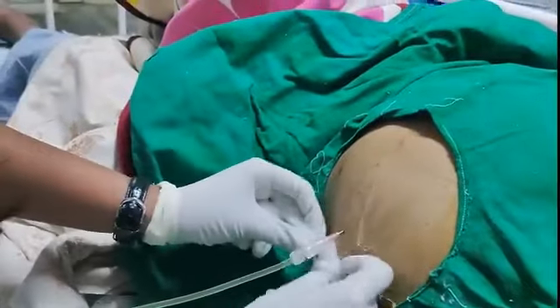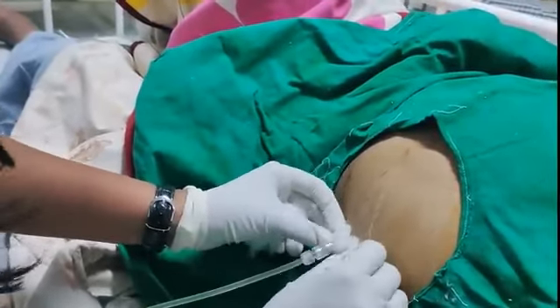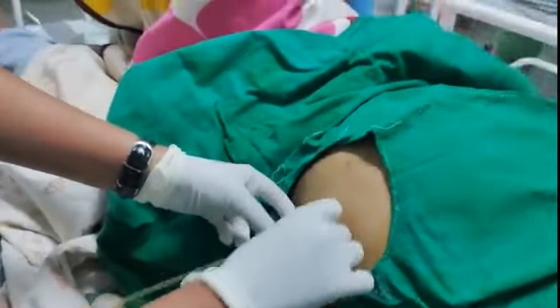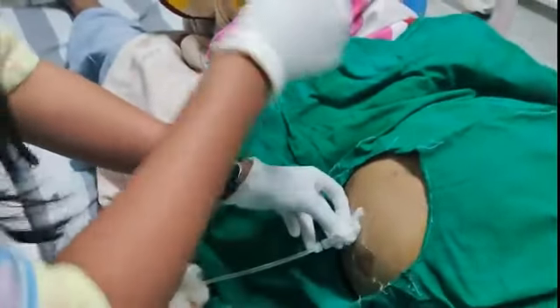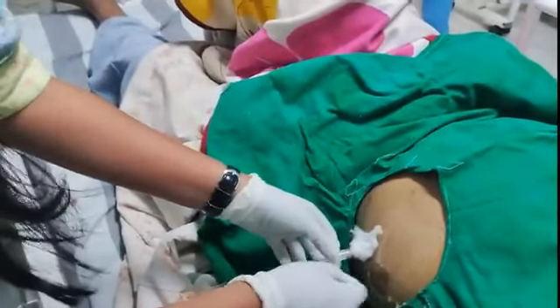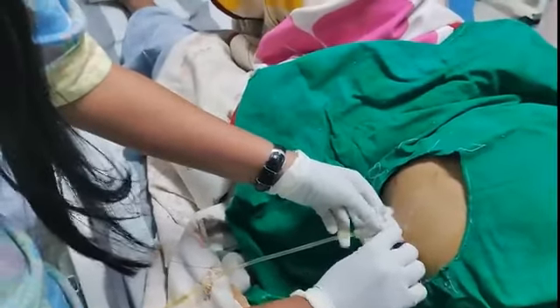The Z-track method is preferred because it allows the intra-abdominal pressure to help seal the tract after removing the needle and decreases the risk of peritoneal fluid leak. Insert the needle slowly to help avoid puncturing the bowel and use intermittent suction to avoid entering into a blood vessel. Avoid continuous suction because this can cause tissue to occlude the needle tip.